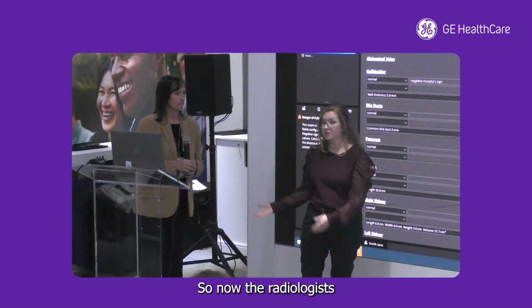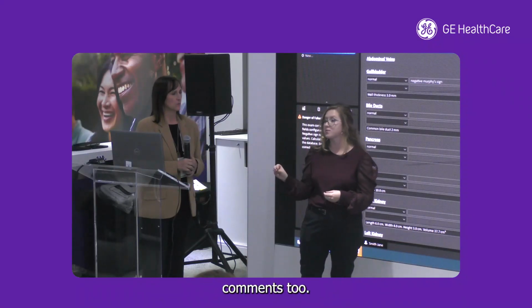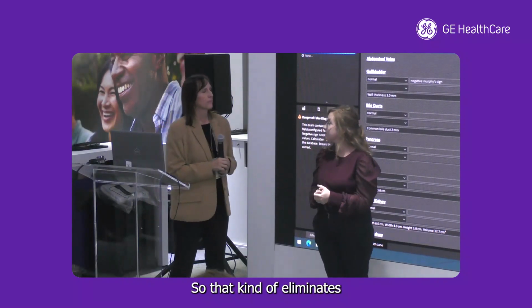So now the radiologists don't have to dictate every single measurement. It automatically goes right into their report. And if you have it set, it can also bring over comments too. We just don't use that at our particular facility, but it has that ability. We just send our measurements over, so that kind of eliminates some of that error there.